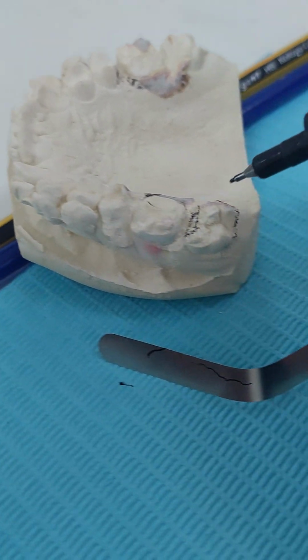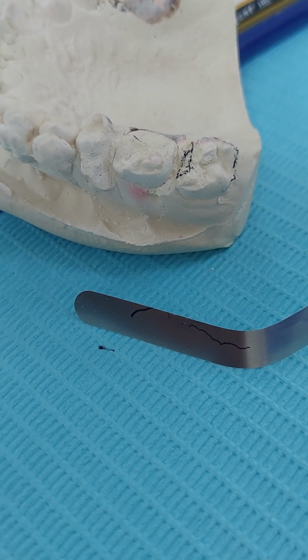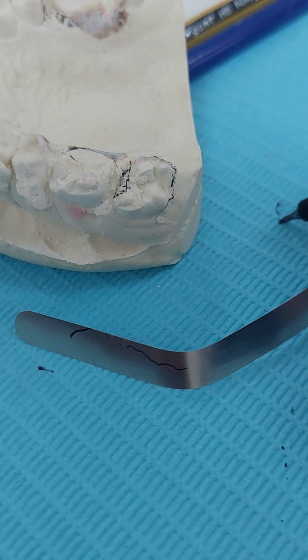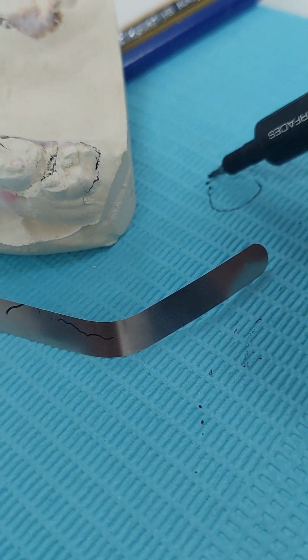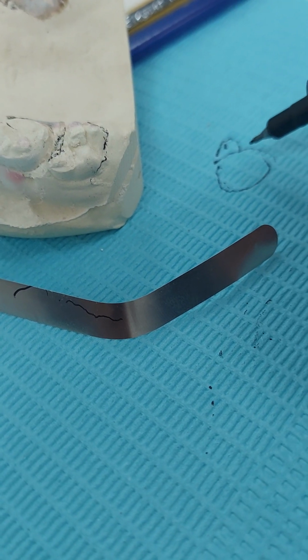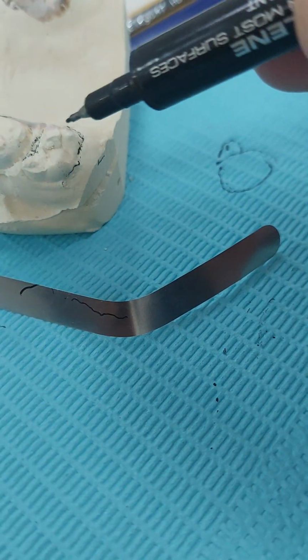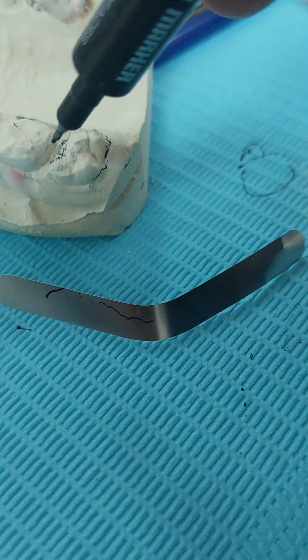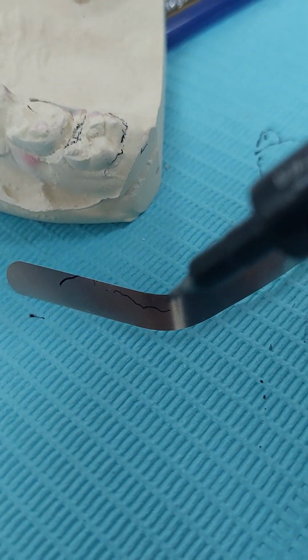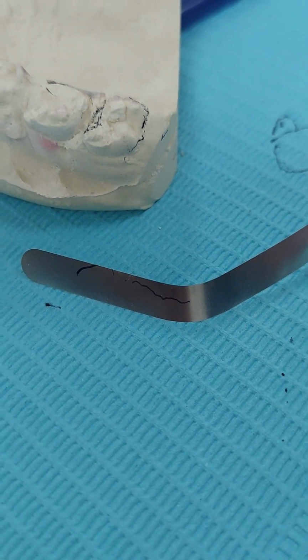Some people will place a regular matrix and then place a cervical matrix, the one that comes along with the holder, rounded like a leaf. This matrix is a sectional matrix. It is for the cervical areas, a cervical matrix. So they will place the matrix here and then add this matrix in between and wedge it. So the cervical matrix will be held by the regular matrix. This is one of the techniques.